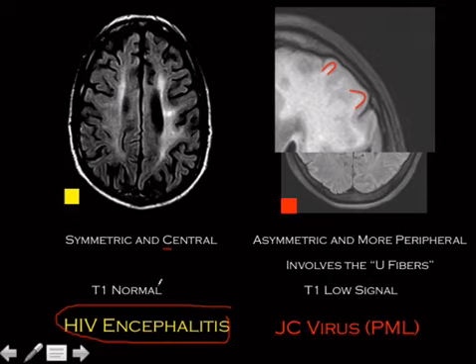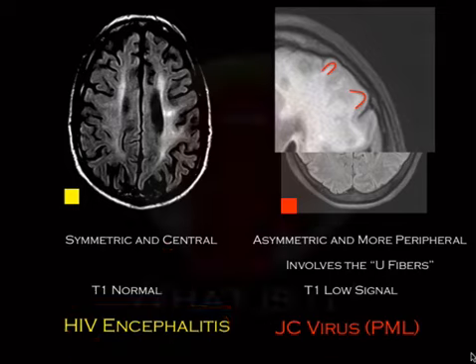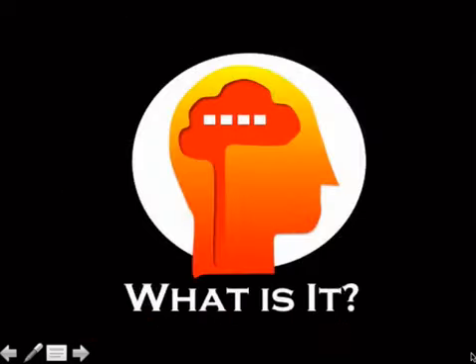And also because it's sort of a common thing, I remember that the T1 is sort of normal. What's more common, T1 to be normal or abnormal? It's more common for it to be normal. So it's just a way to remember it. And then the other ones are the other ones. So, all right, moving on.